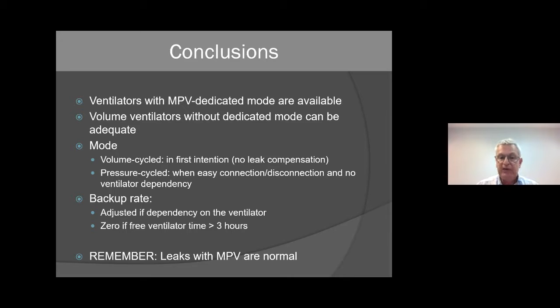If you want to use the pressure cycle, it is not easy to use, and when the patients really are dependent on the ventilator, our experience is that it's hard to use. But we found in some children, especially with SMA children, that they sometimes like to use the pressure cycle, and the reason is that there is a quick rising in pressure, and they like to have this feeling of quick stretching of the structures.